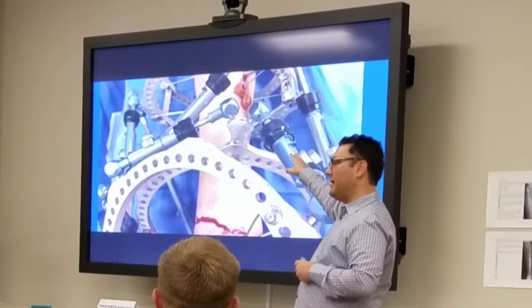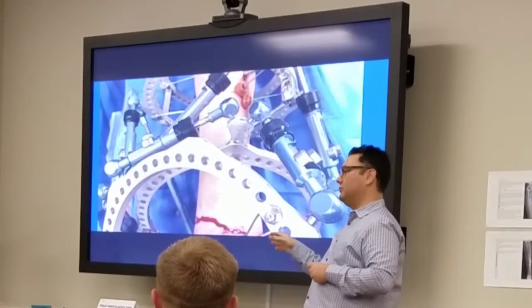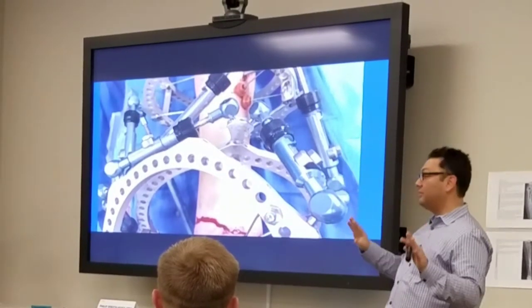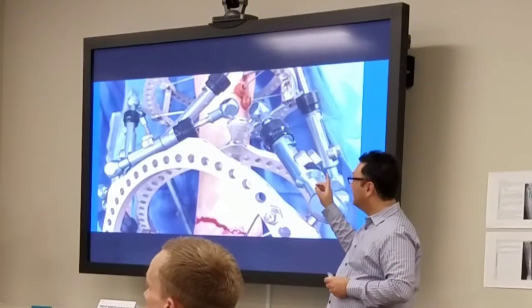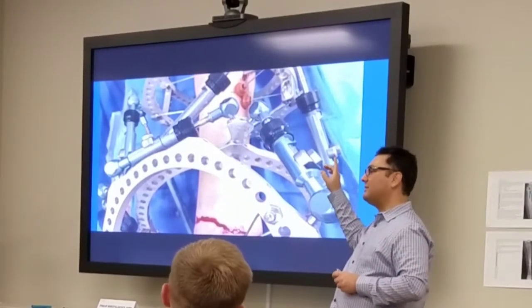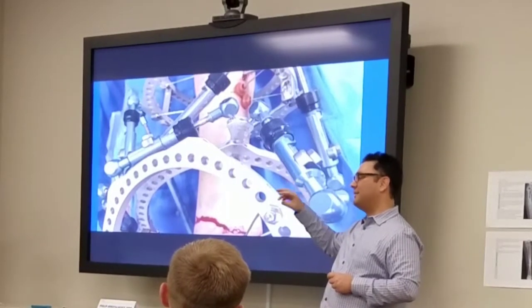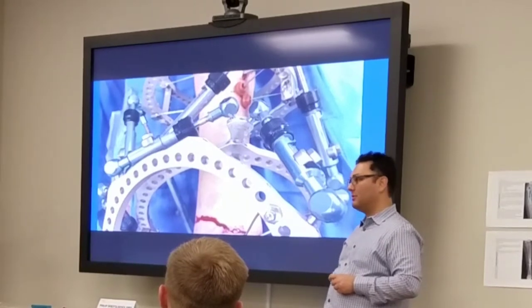You just put on the emergency tab, and there's nothing in the computer that says you have an emergency tab there. The computer doesn't ask you that. Your settings don't really change. It's not that strut legs don't change, it's that your deformity correction is not affected much by an emergency tab. That's why it's called an emergency tab. They put it in case of emergency.